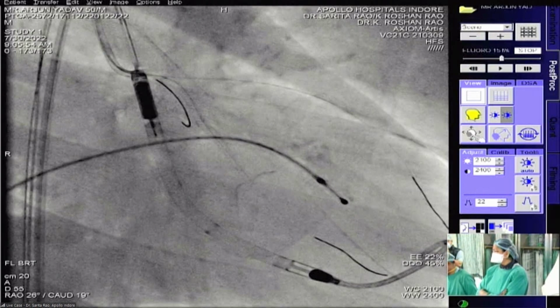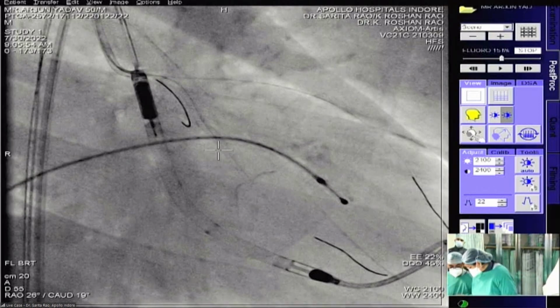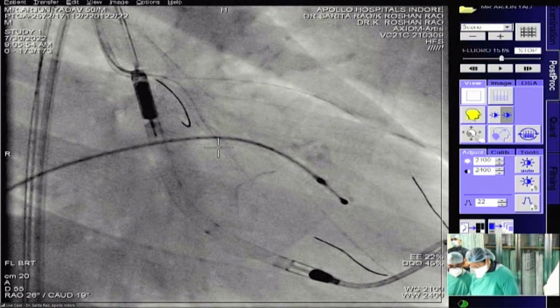And the provisional stent is my strategy as well. Yes. What do you do, Dr. Benson? Yeah, I would go the same way. I would stent from left main into LAD and then do a POT, re-enter the circumflex, balloon dilate the struts, and then do a repeat POT. That's what the EBC does currently.